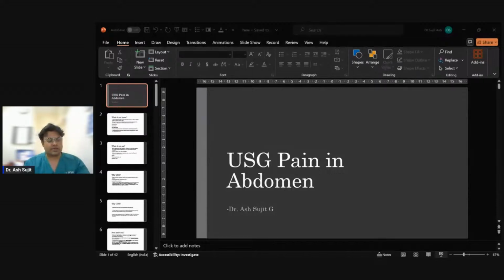That is a follicular cyst, which is there. Now what happens is, throughout ovulation, a corpus luteum forms. The corpus luteum usually involutes after the menstrual cycle ends, by the time menstruation is done. Occasionally, fluid may persist in the corpus luteum and increase in volume. This can lead to development of a corpus luteal cyst.